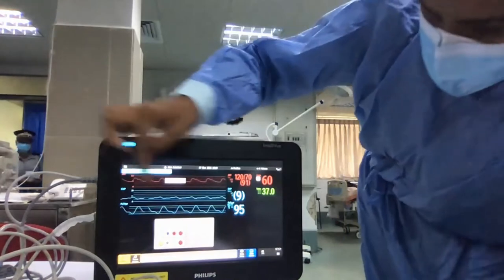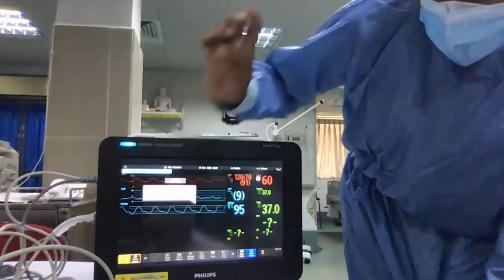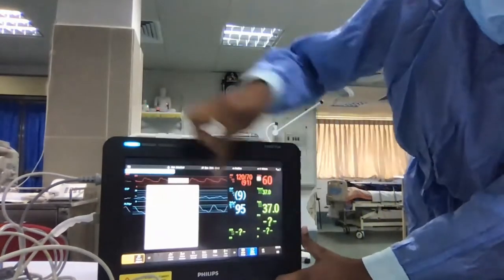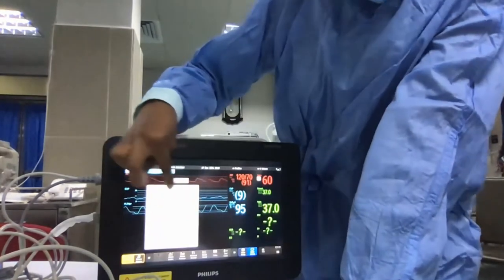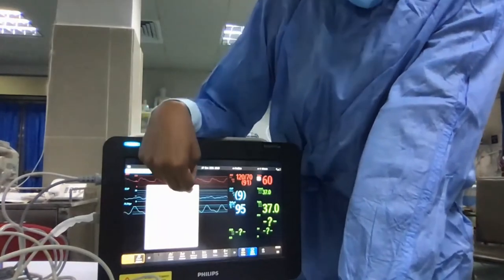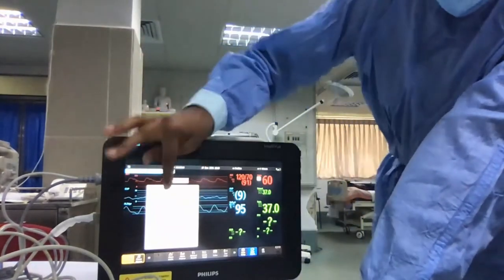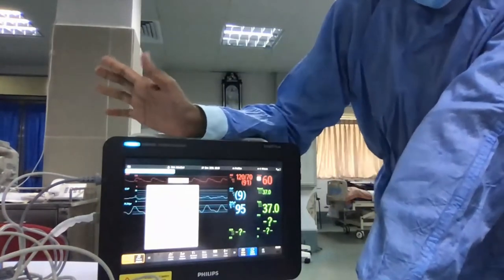Then go to setup cardiac output. The setup cardiac output menu will pop up like this. First of all, here we need to select the correct method of monitoring cardiac output, because there are two methods. One is the transpulmonary method and the other one is the right heart method. For the moment, we will be using the transpulmonary method. So first of all, select the source, which method we are using.